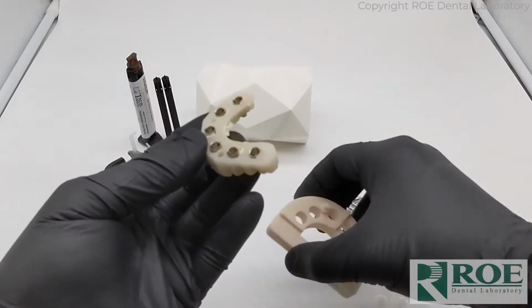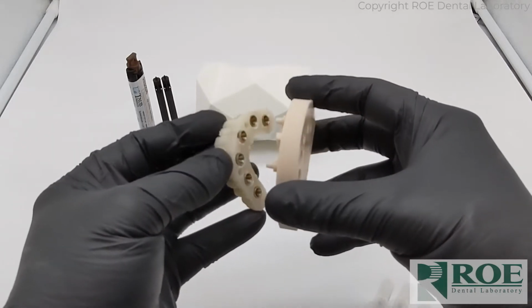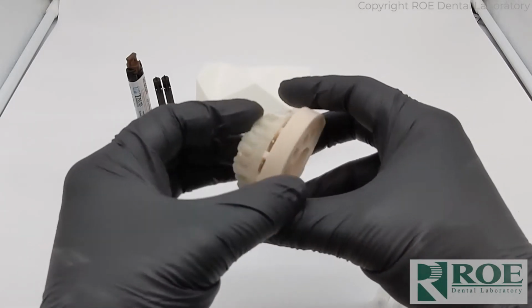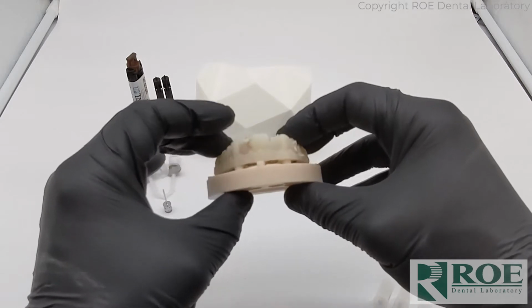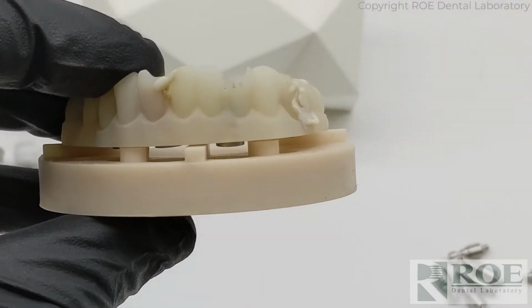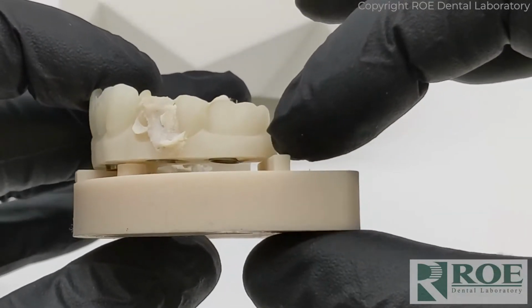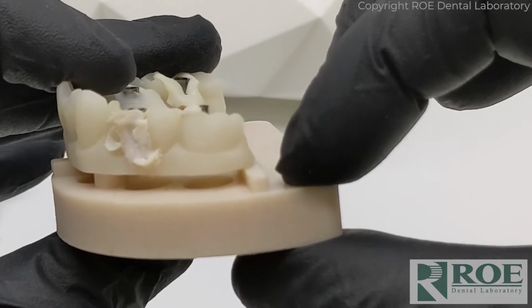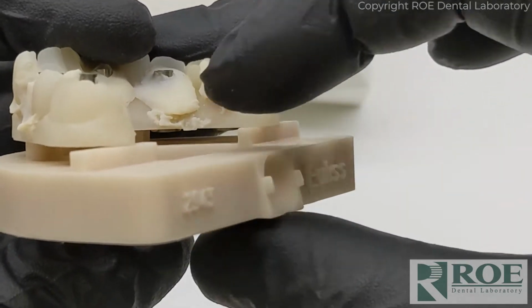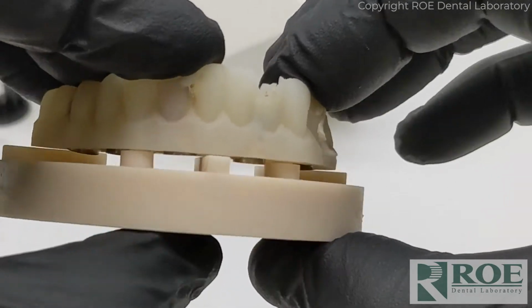Okay, RAPID appliance comes back into the laboratory, and the first step is to make sure that the RAPID appliance fits onto the roto model. It's very important that it fits very nicely. I'm going to zoom in here and we'll show exactly how it should be fitting. So these are supports on the roto model on this side and this side. You can see both these supports here. And then there's supports in the anterior as well.